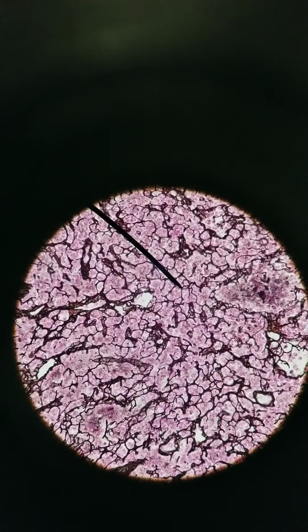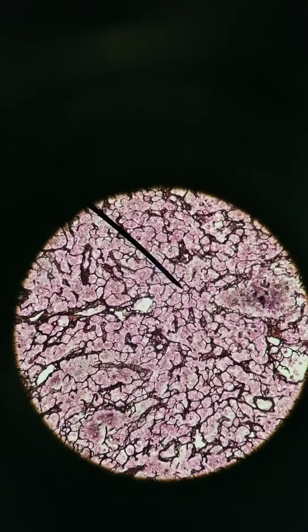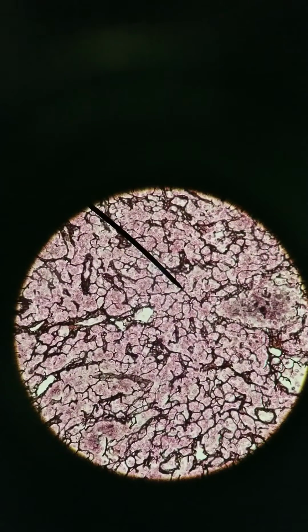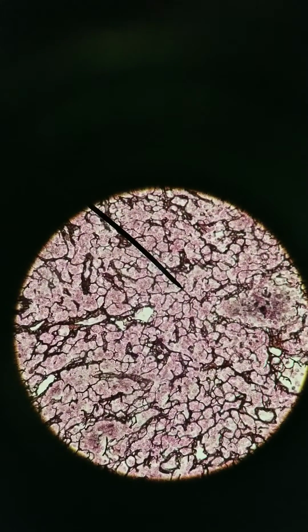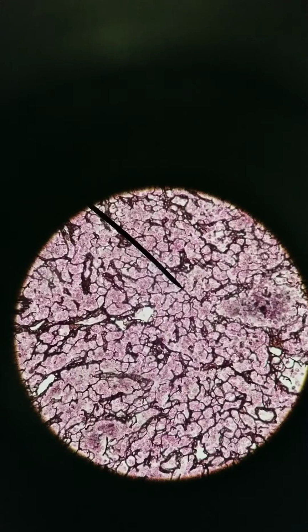The nuclei, those cells, I forgot to mention this with areolar, those cells are called fibrocytes, or maybe I did mention it. Well, these cells are also called fibrocytes. The dark branch fibers, those are reticular fibers. So areolar tissue did have reticular fibers, but this only has reticular fibers, and they're very dark, very branched, very prominent. They're found in organs that are more rigid, like the liver, the kidney, spleen, lymph organs. Provides support.